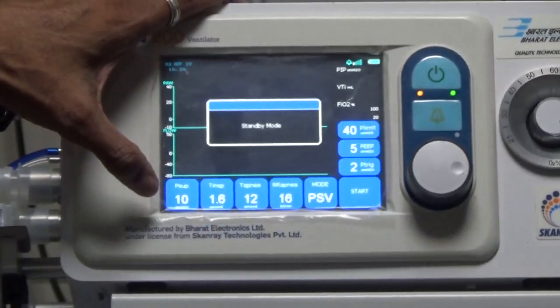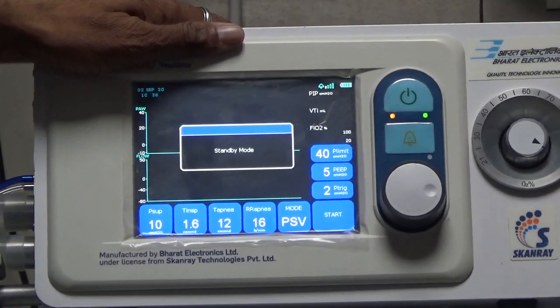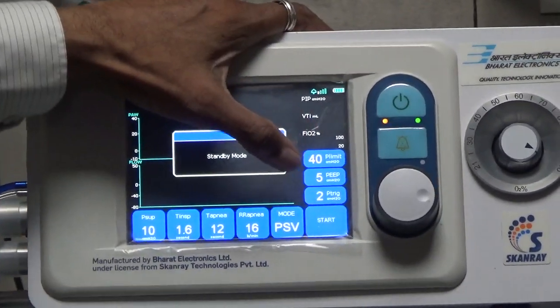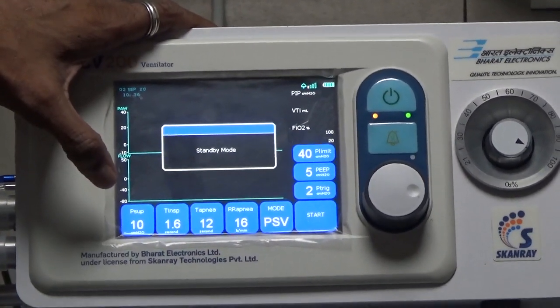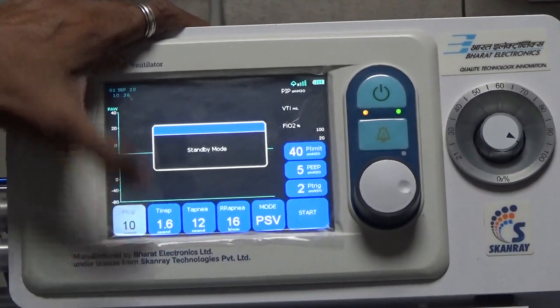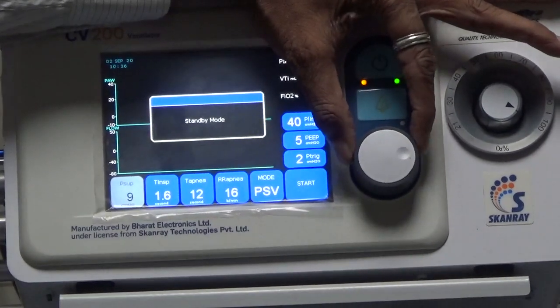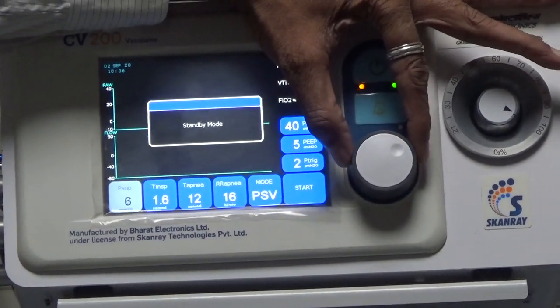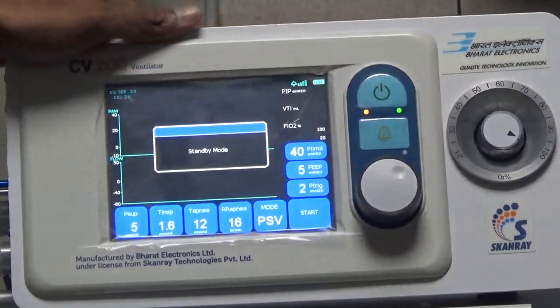When there is a pressure support of 10, the total pressure that builds up in the machine is 10 plus 5. Now, when we are starting, we don't want a pressure support of 10 because that will make it more difficult for the person to breathe. So we will start with a pressure support of 5. So I select it, that box becomes white, then I can use this knob. If I turn it anti-clockwise, the pressure support reduces. I've got 5 there and now I select 5.